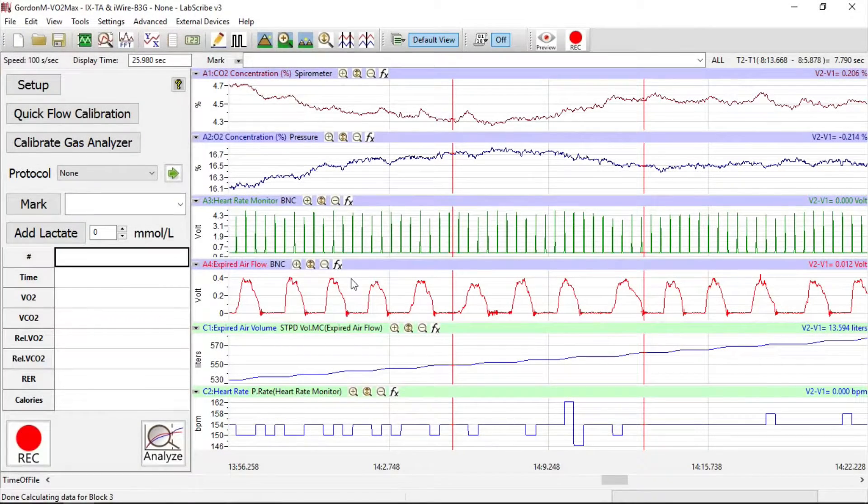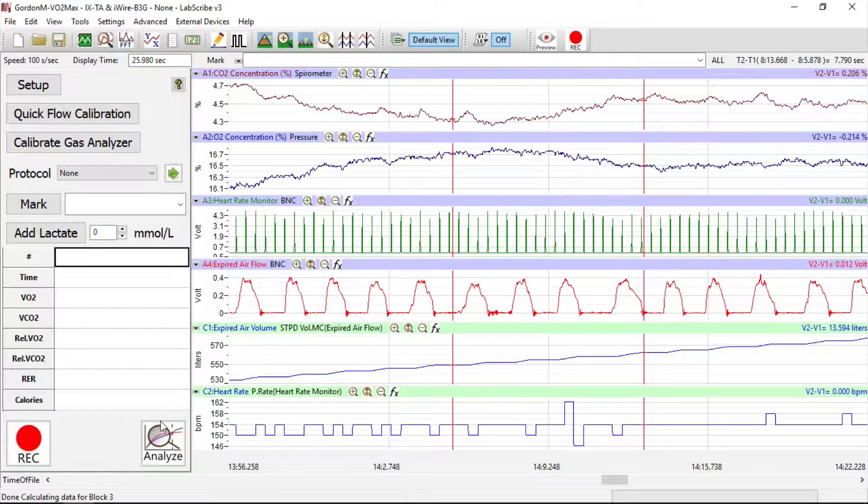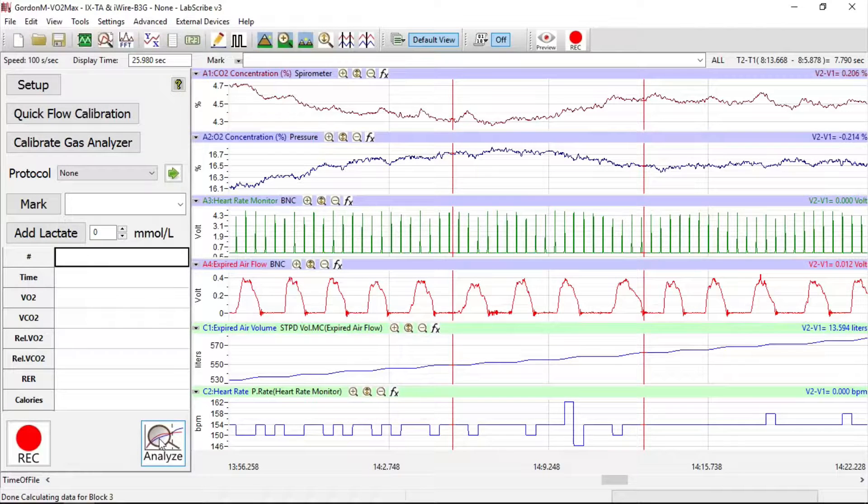In LabScribe, here's a metabolic trace that had been recorded. To analyze the data, click the Analyze button.